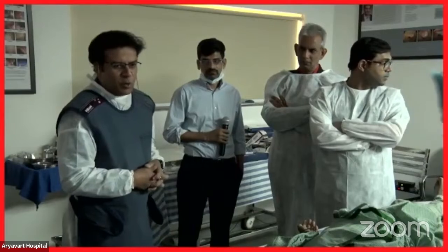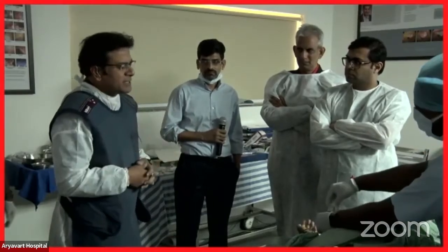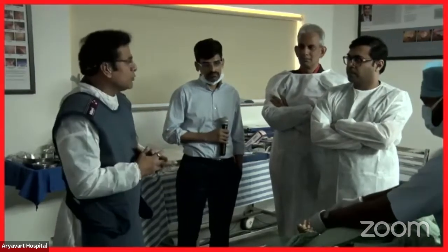Surgeons are very much attached to where exactly you make an anastomosis. What I usually do is go to the part of the bowel nearest to the stomach. I don't search for any specific segment of the jejunum or any specific site in the stomach to puncture.